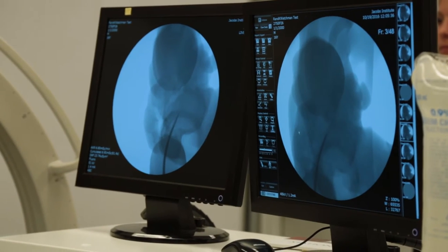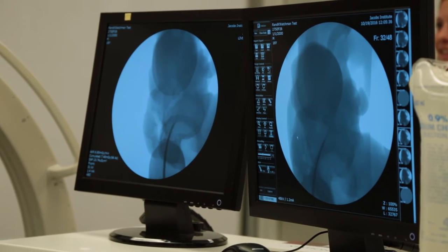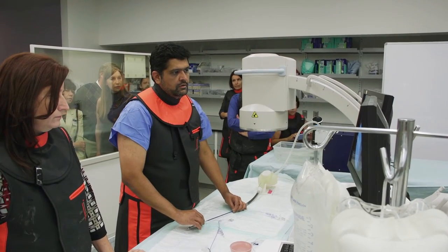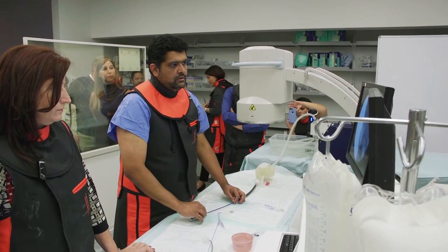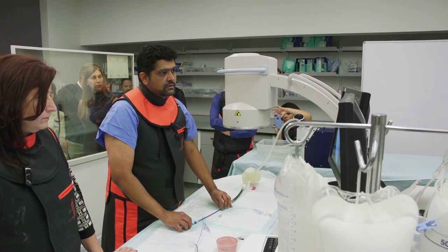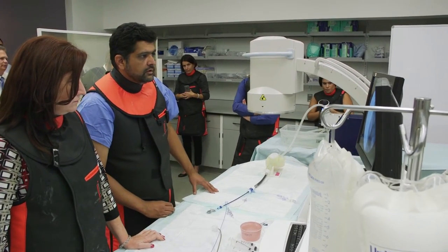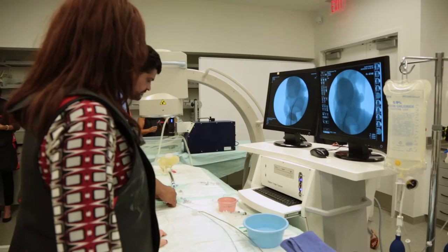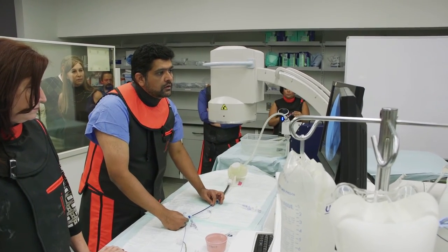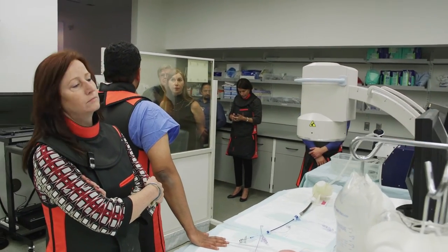Somewhere in there is a hole — I think it's pre-made. I don't know if I'm going to be able to find it today, but maybe I will. And maybe across. It certainly looks appealing. That is the first step of the procedure, which is to do transseptal — coming into the left atrium.